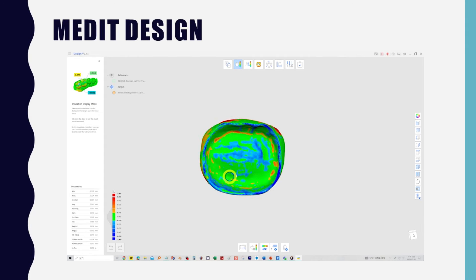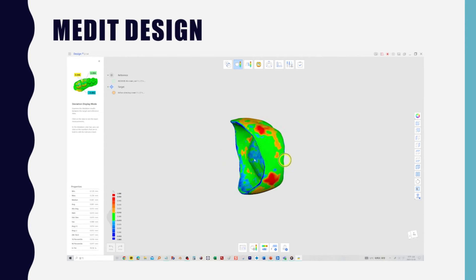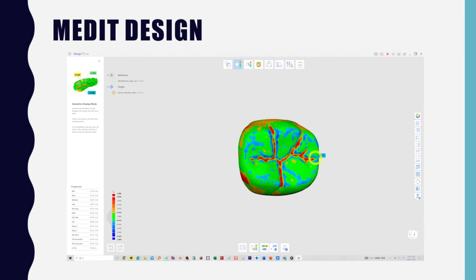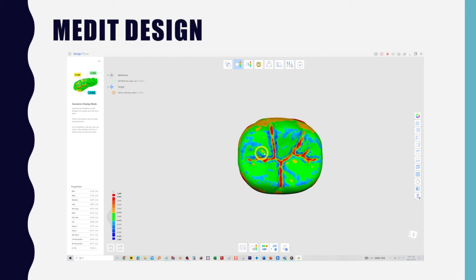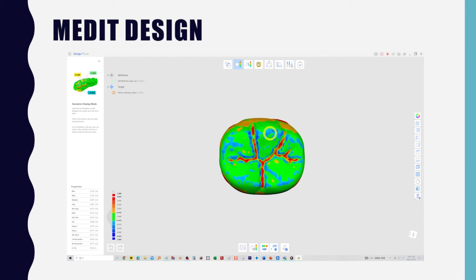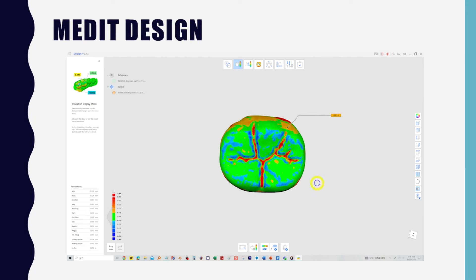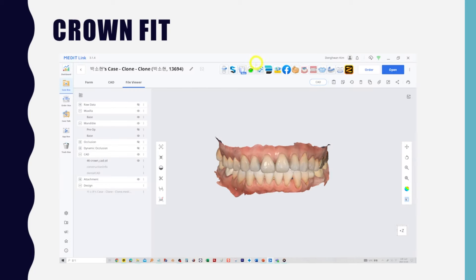Modify the scale on the left in 10 micrometers increments. Overall, you can see that the machining is good with an error range of plus minus 20 micrometers. This is a way to compare the machined crown with the original design file to see where machining errors occur.